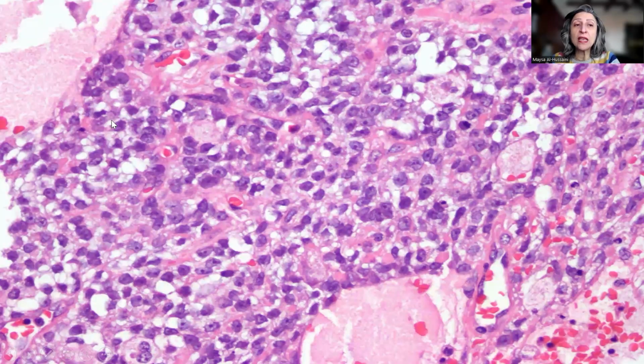And then moving again more towards the areas where we have the myxoid degeneration and some macrofollicle formation. There isn't any microfollicle formation. There aren't any Call-Exner bodies, which is again characteristic of the usual pattern of growth of a granulosa cell tumor. And as you can see here, again, more of the acidophilic cytoplasm of the tumor cells started to appear along with the vesicular nucleus and the small prominent nucleolus.